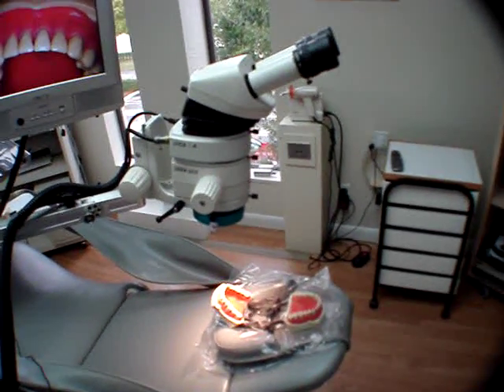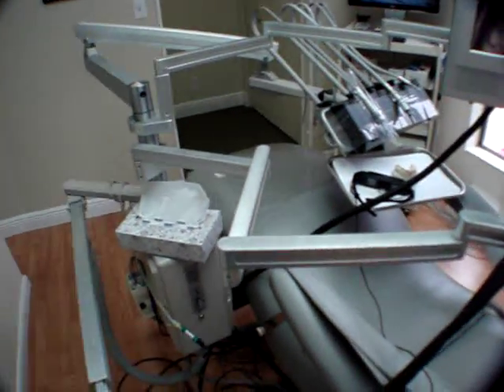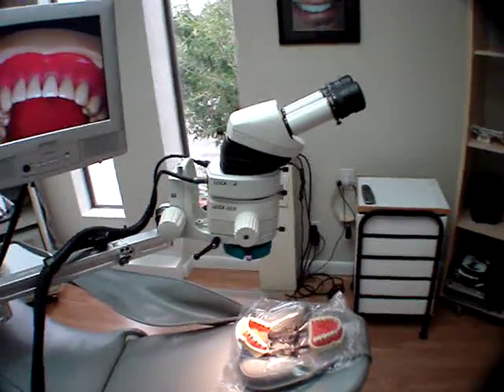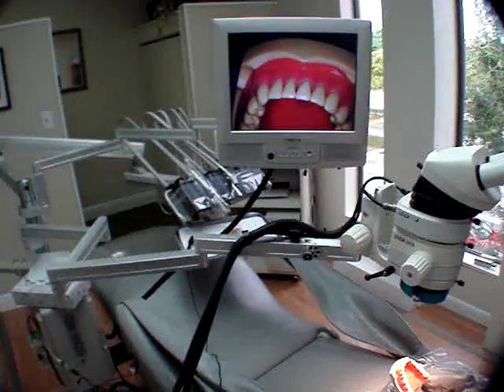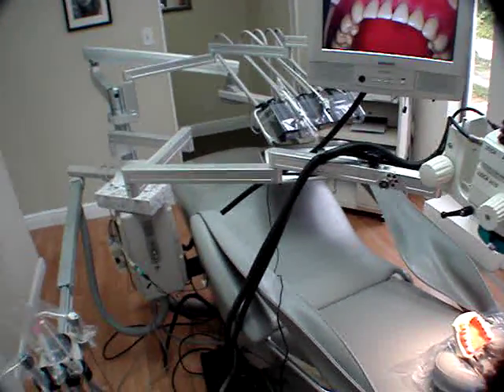The microscope, as I said before, is attached directly to the dental chair itself, and that makes it very, very easy to use day in and day out. Notice we do not have any other hardware in the office, and so we keep it simple.